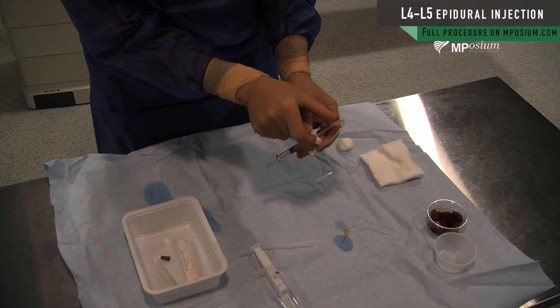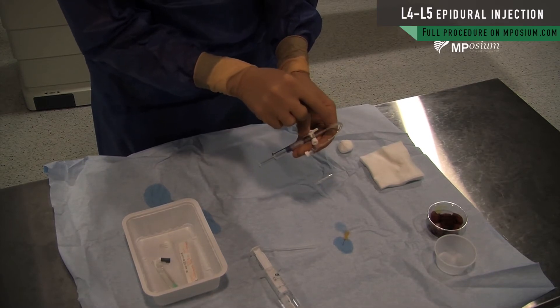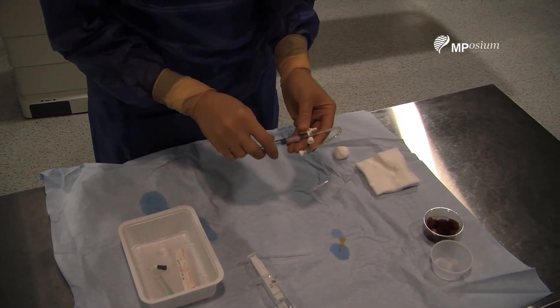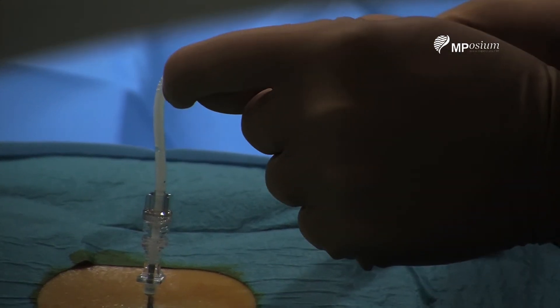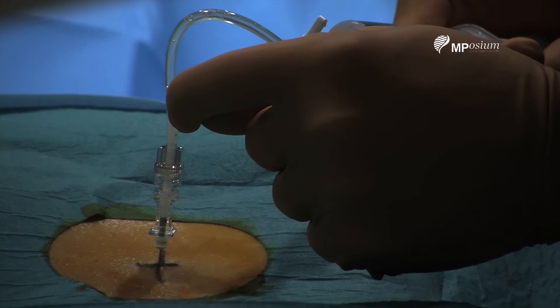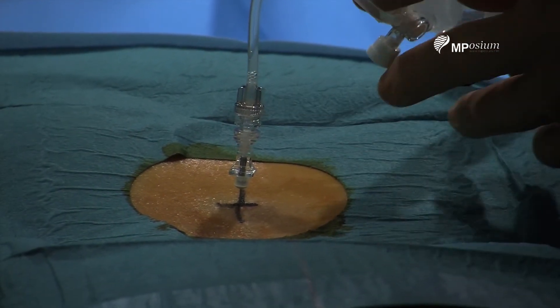I have half of the connector with air, and with this air I will test the ligamentum. You can see the corticosteroid getting inside. Everything is inside.